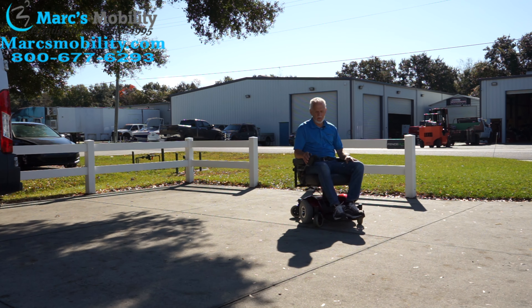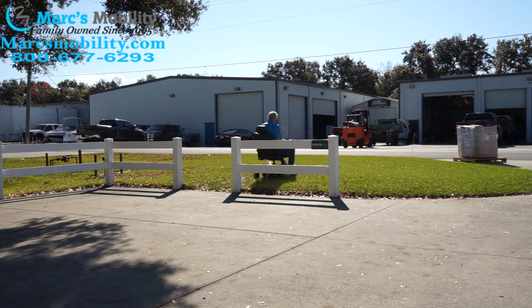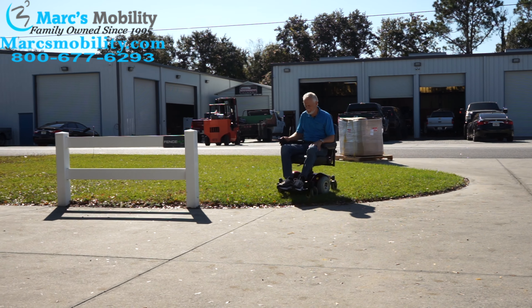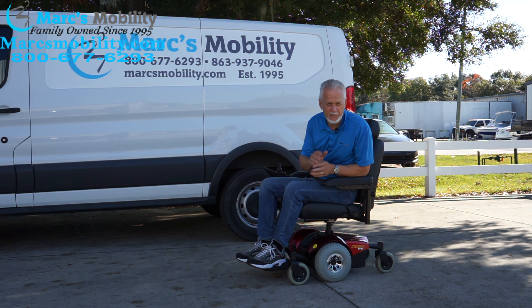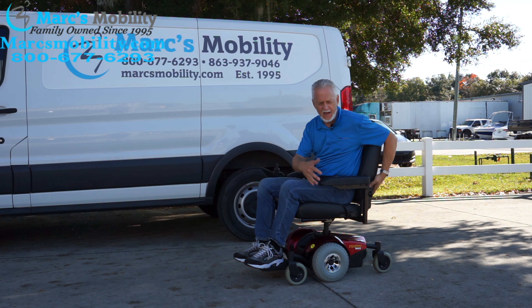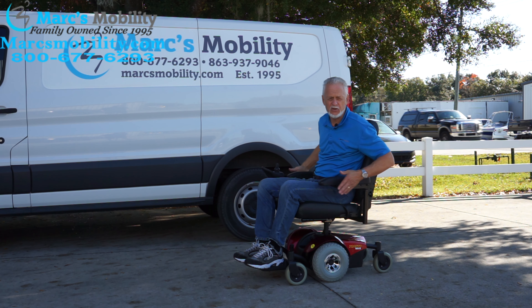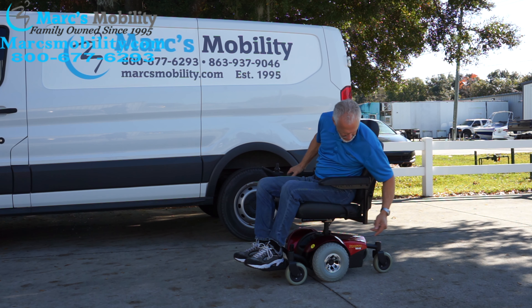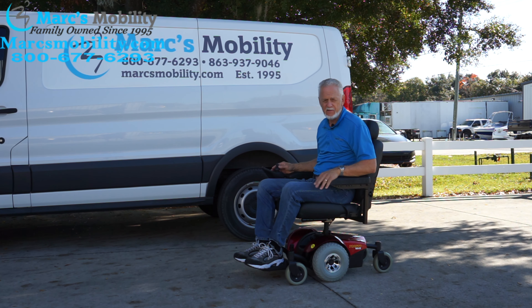Very small turning radius. Very nice power chair. This is really not a yard chair where you can use in the yard, but it does go through some grass. So this is the Pronto M41, practically brand new, with the 19 by 19 nice captain seat, really small turning radius. Total width of the chair is about 23 and a half inches from outside arm to outside arm. Solid tires — just a good small power chair. If you need something real small and compact for your house, this is a nice one.